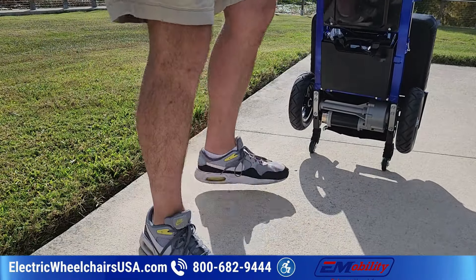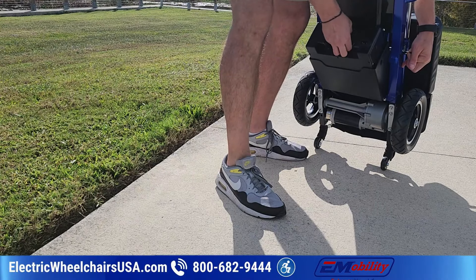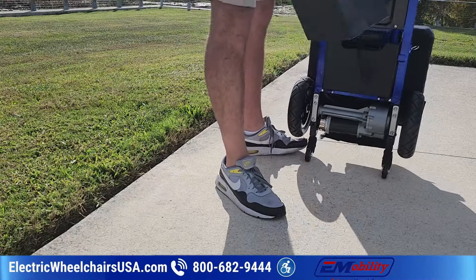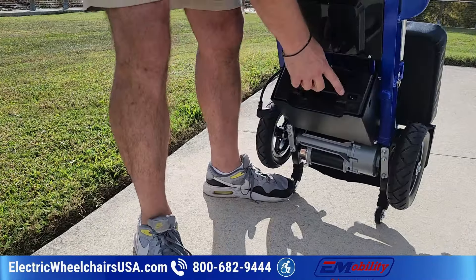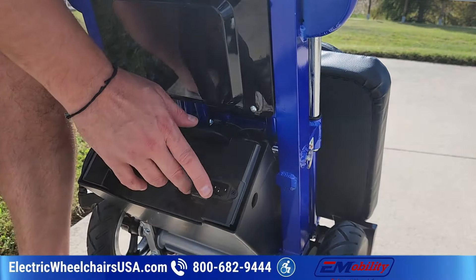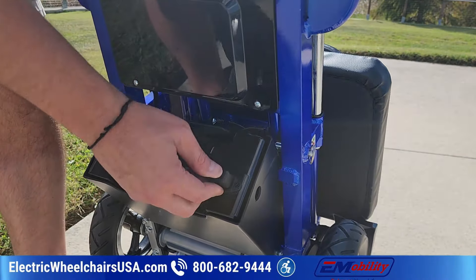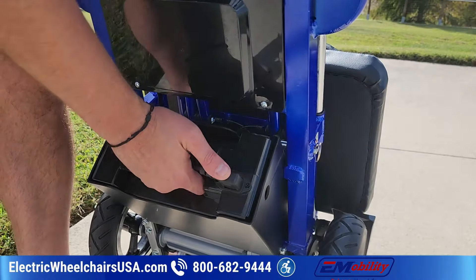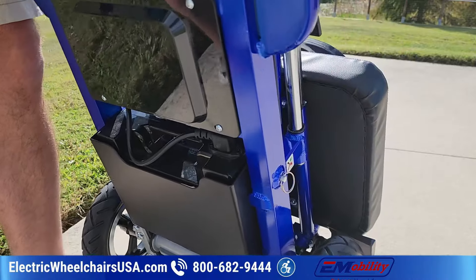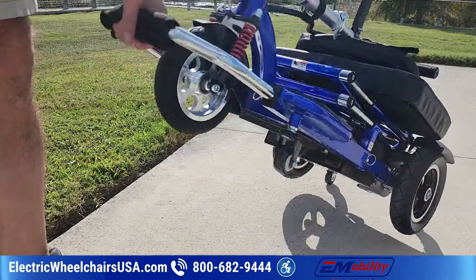At this point you can wheel it behind you or set it up flat. Pull this pin and that's how you remove the battery — it's best to remove the battery after you have it folded so you can just bring it on board with you. This is also where you charge the battery, so you charge it directly on the battery. When you're ready to turn it back on, pull the pin, fold it back up, and it locks into place. Then you can wheel it behind you like a piece of luggage in the airport.